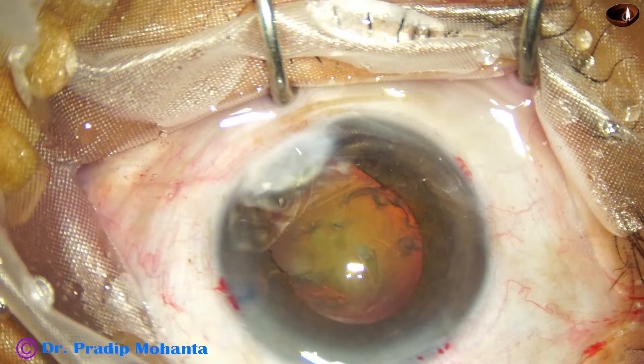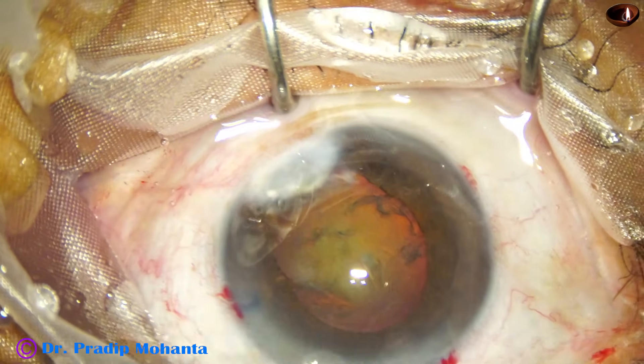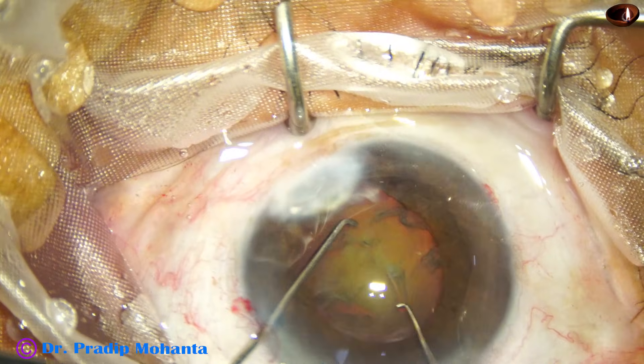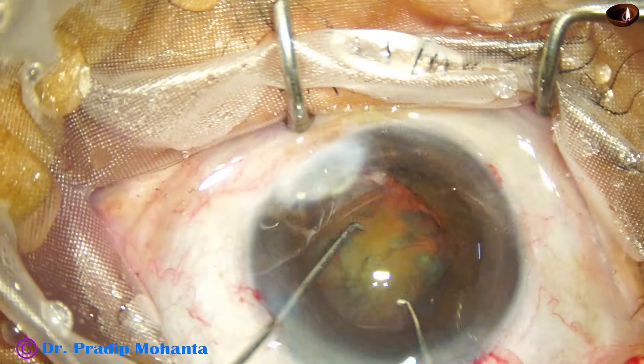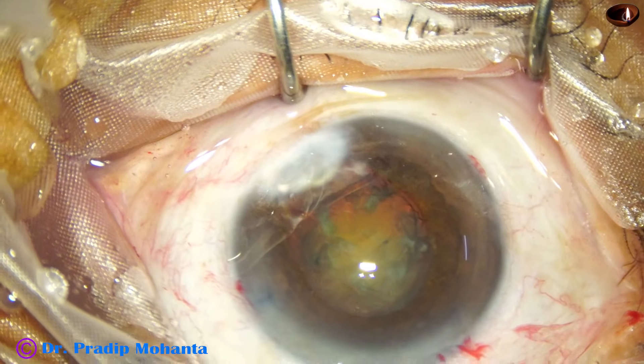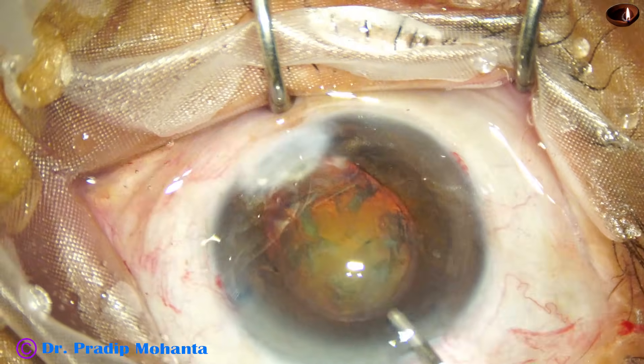Then the chamber is filled again with viscoelastic. In such cases I rotate the nucleus bimanually. When there is zonular weakness, we should rotate the nucleus bimanually.